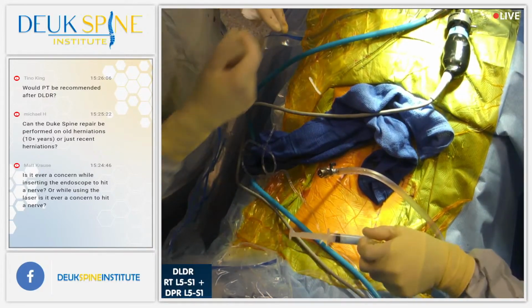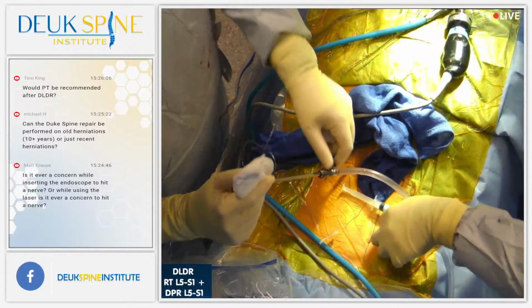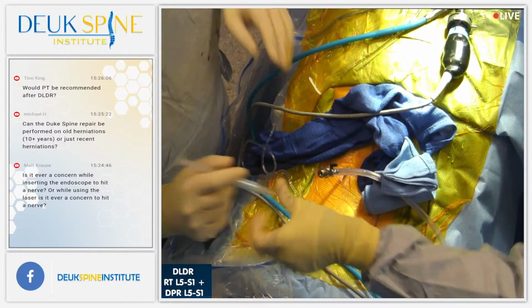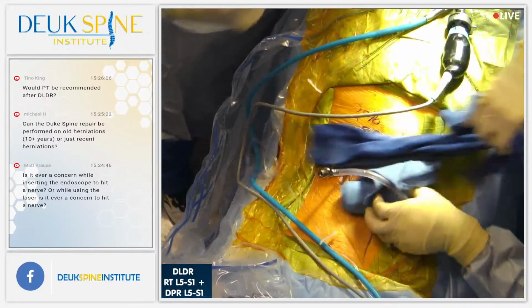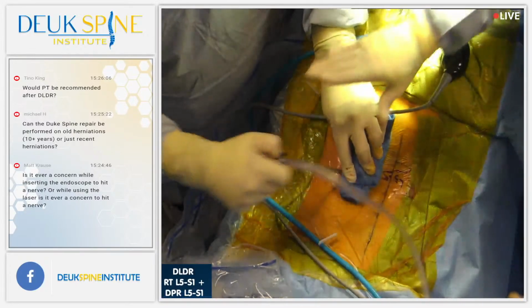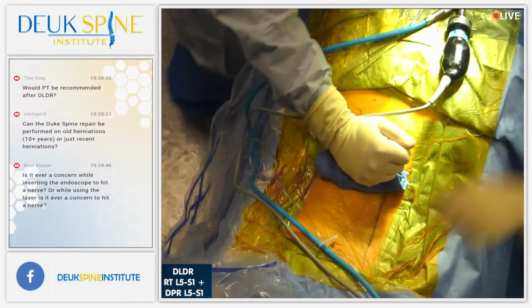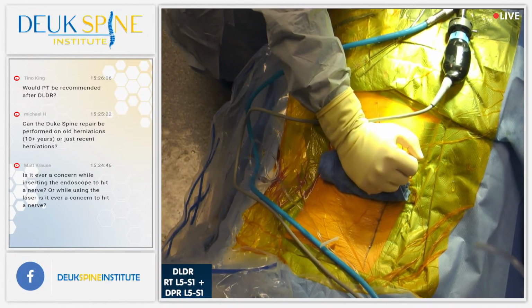And I use the X-ray machine, which is the top of the line machine in the world. We have a Siemens Flow, right? Which is number one, has the best quality pictures, the best resolution. It's just the best. And we have 2 of them we just bought, so we could take better care of our patients. And you can see everything clearly, clear enough to make sure you don't have any complications.